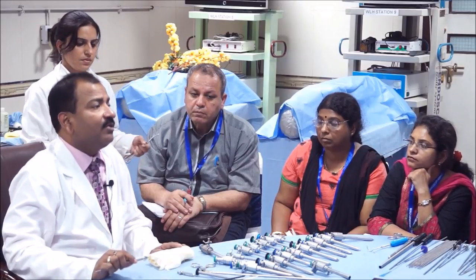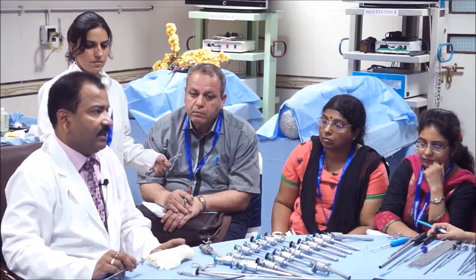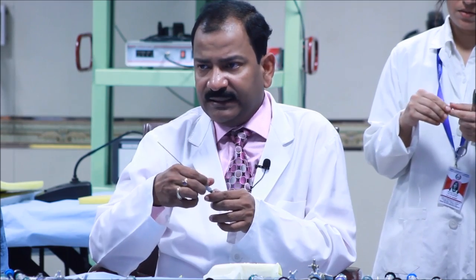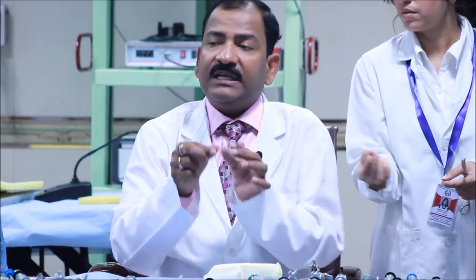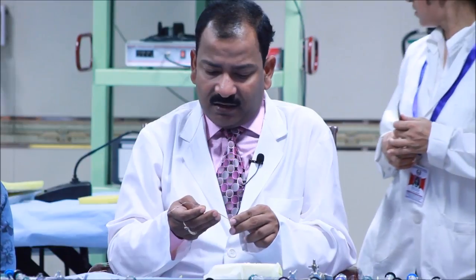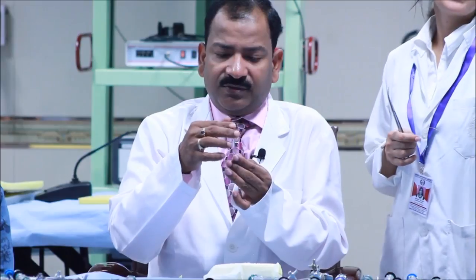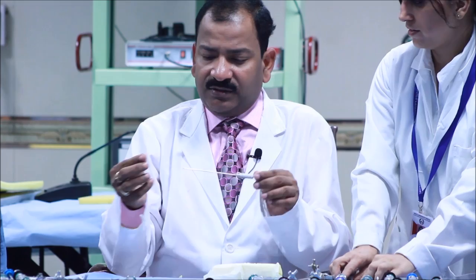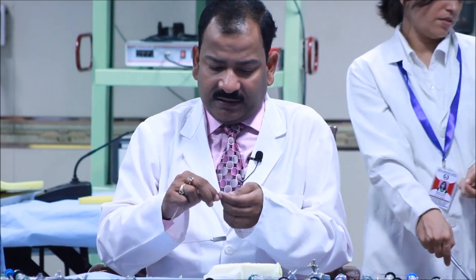Now, another very good use is that it is a very fantastic port closure instrument. It can be used for port closure. How? You have to open it, remove the stylet, and put one suture into the Veress needle. This is a Veress needle, you take any suture. You can use nylon, catgut, or PDS, and introduce one suture. After introducing the suture, can you see that? This is the suture. And then tie a knot. Just tie a knot.